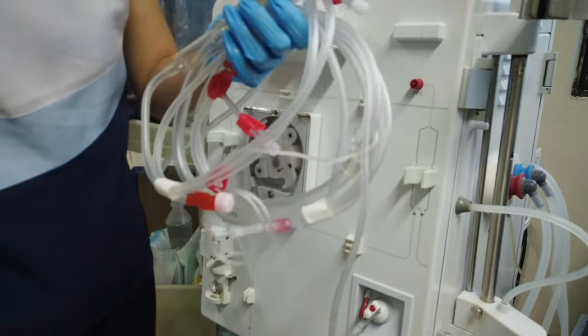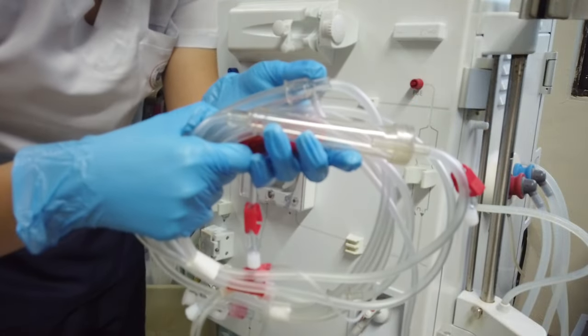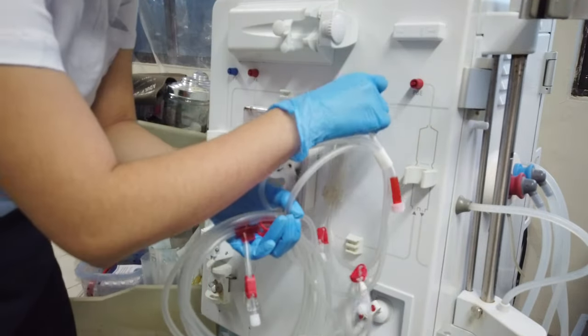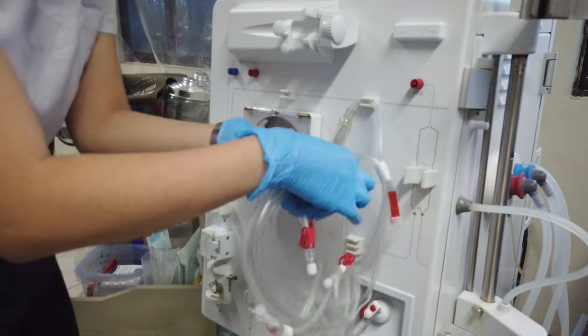Let's start with the arterial line. Do not remove the paper cord ties, or else this might turn into a tangled mess. Let's start with the drip chamber. Place it reversed onto the holder. In my case, I just clip it for easy removal once filled.